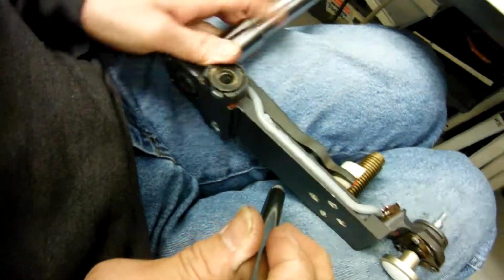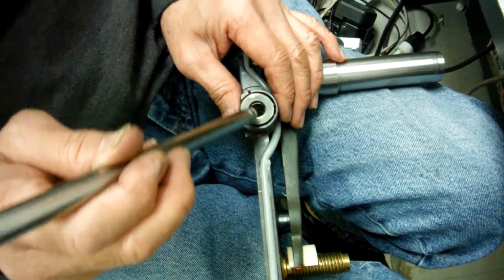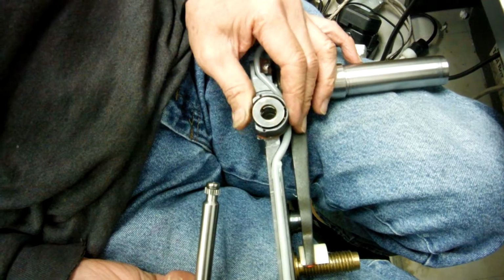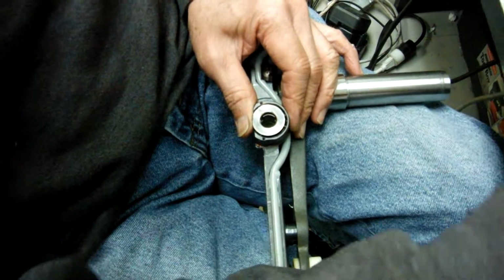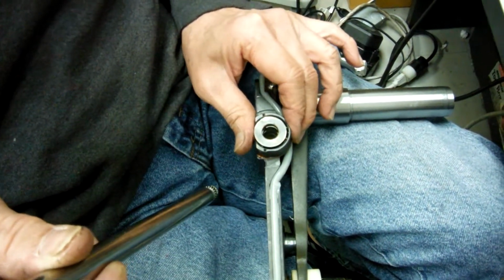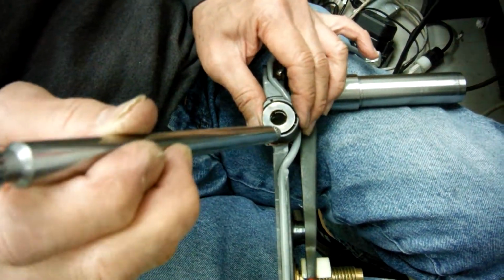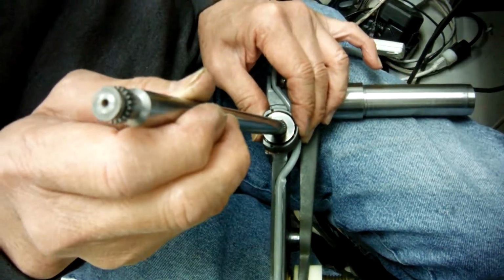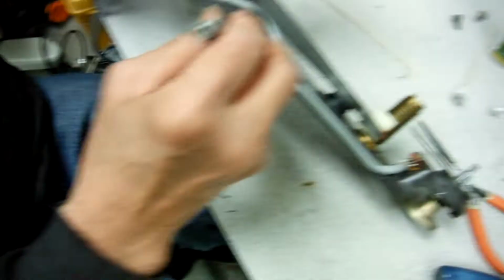when you put the shaft in, try to go in this way, because if you go the other way and if it's not in the center, you might be pushing the top out and the spring is going to be taken out of there, and you will lose it, and then you cannot find any spring to put it back in there. So make sure you go in from this end while your thumb holds the bottom there, so you can move back and forth to center as long as you put the shaft in there first, and then we adjust it later. Okay, so hold this bottom and put the shaft in there and then release it.